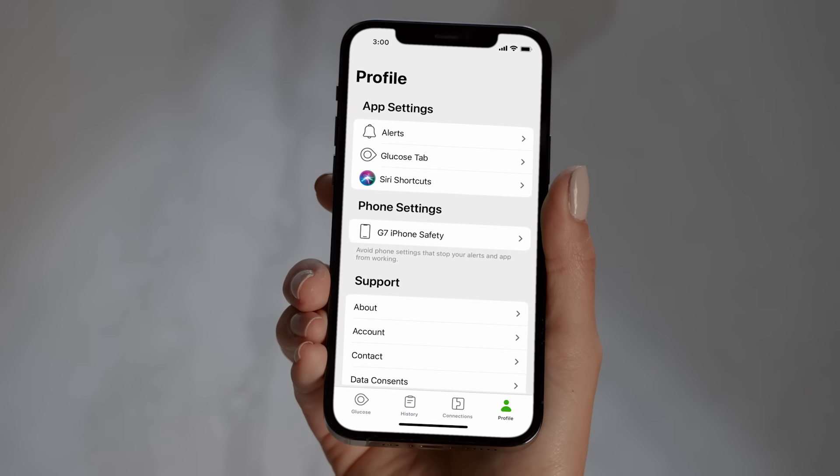Remember, you can customize your alerts at any time under Profile Alerts.